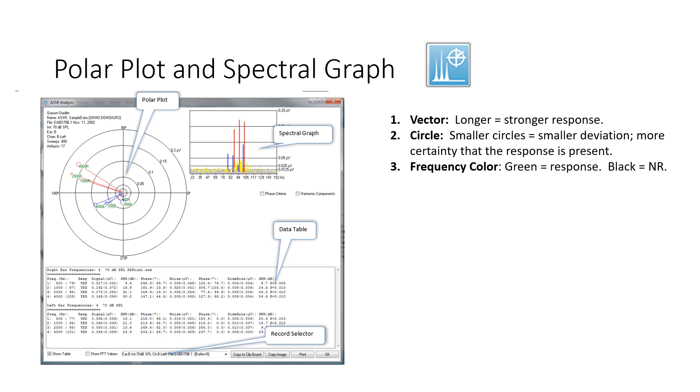So if we look at the polar plot of this test data, the right ear responses are longer and therefore stronger. The circle at the end of the vector indicates the deviation. The smaller the circle, the smaller the deviation, so you're more certain that a response is present.